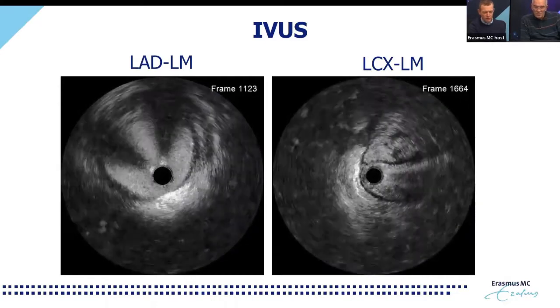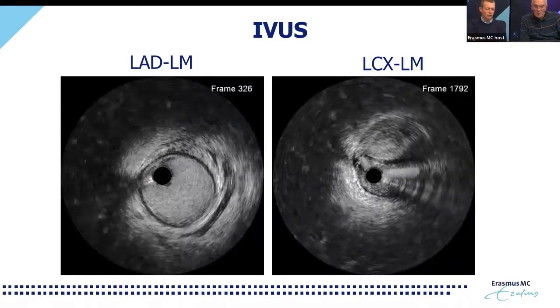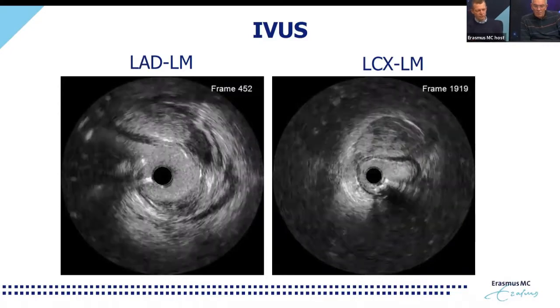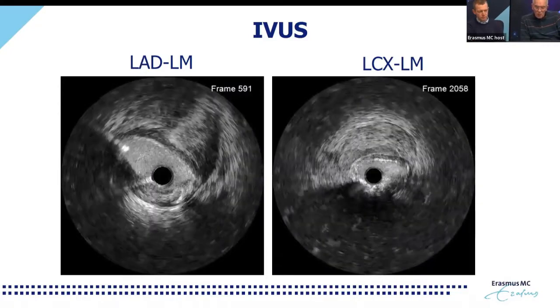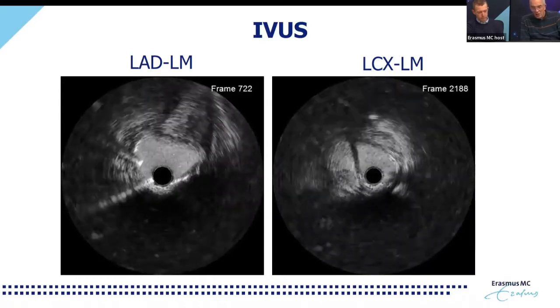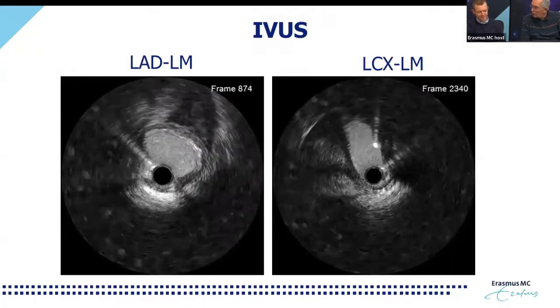The only thing is, it is being compressed from the outside by hematoma that is, exactly as Jurgen mentioned, submedial, as we call it. So in between the media and the adventitia. You can recognize that because this submedial space is blowing up like a balloon. Yeah, because there is some elasticity, but there is less power to counter pressure.